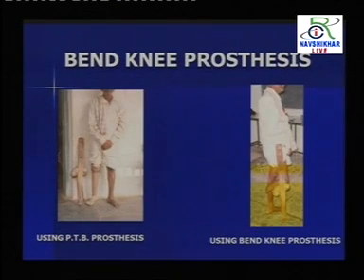एक रेगुलर प्रोस्थेसिस भी यूज़ कर सकता था जो पेटलर टेंडन बेयरिंग था, एंड दूसरी साइड पे बेंड नी प्रोस्थेसिस लाइक एंड वेट बेयरिंग प्रोस्थेसिस, वो दोनों ऑप्शन उसके पास थे. ही वॉज यूजिंग बोथ द ऑप्शंस. तो ये उसके लिए काफ़ी कंफर्टेबल हो गया.